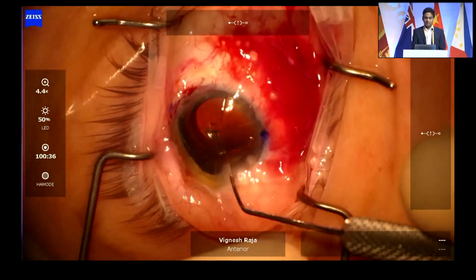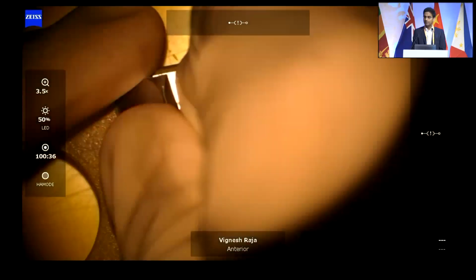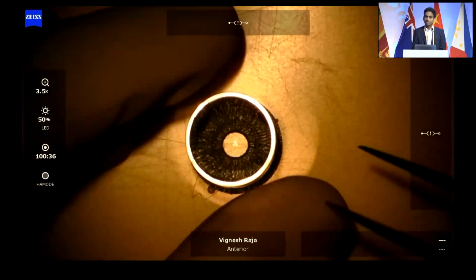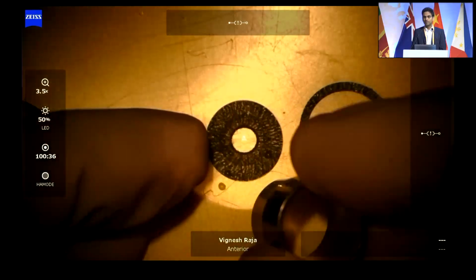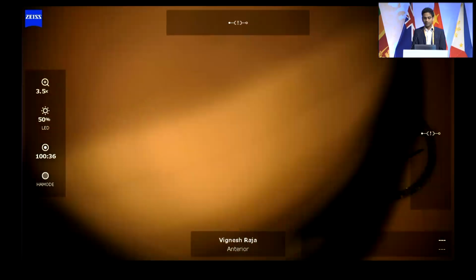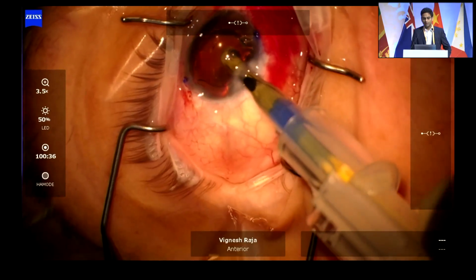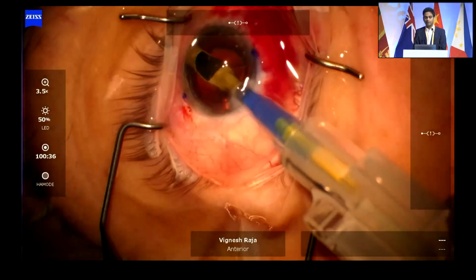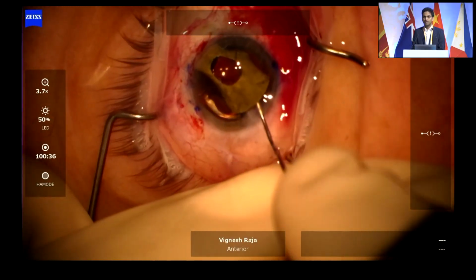Now, because this person has a permanently dilated pupil, I implanted an artificial iris prosthesis in the sulcus as well, because I thought it was so dilated that I didn't want to do a single pass four-throw pupilloplasty with that. So I used an artificial iris and made a small PI in it. To size it well, you take the vertical and the horizontal corneal diameter, take the mean of it and minus 0.5, so that you get a good size.